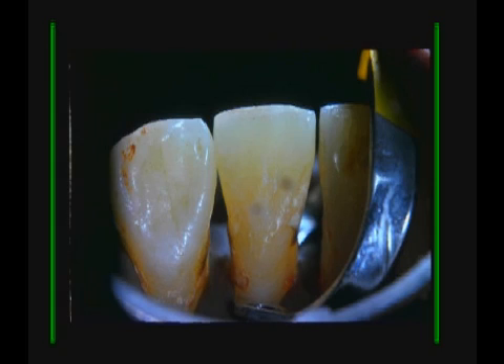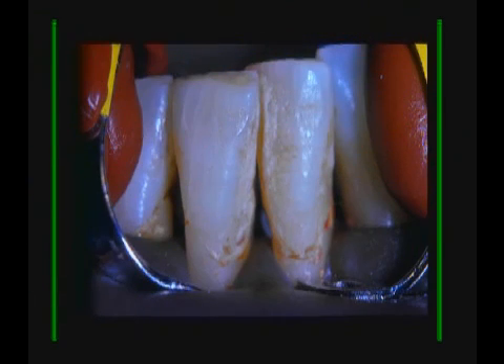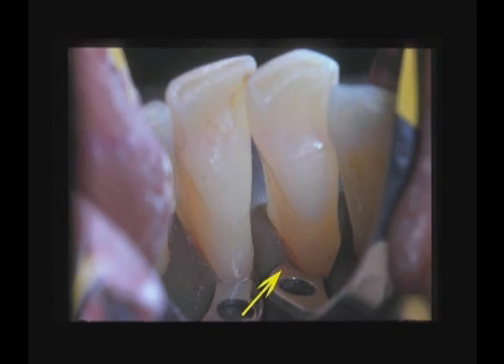You can see the calculus, and if you can see it, you can remove it. You can re-plane your teeth perfectly smooth, as we've done here with our B4s back to back, stabilized with compound. Now we have the access to the calculus that we need and it's no problem to clean it off and get your teeth glass smooth, which is what I call it.